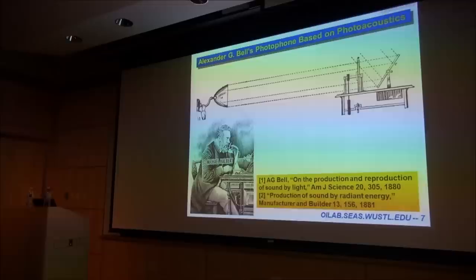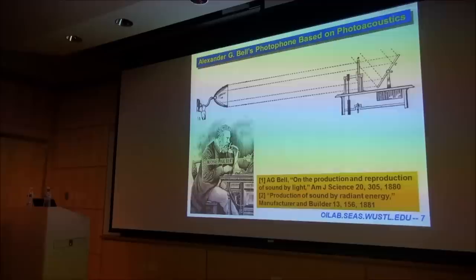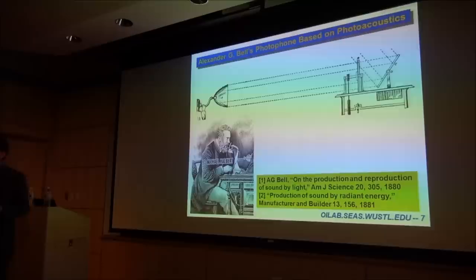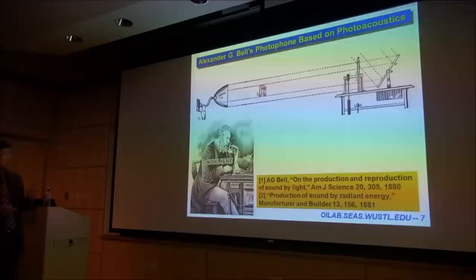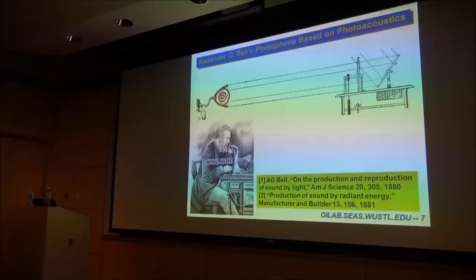As a physical phenomenon, photoacoustics has been around for quite some time. Alexander Graham Bell first reported the photophone over 100 years ago. Instead of building a telephone, he said, well, let's build a photophone. The idea is to encode a sound wave into a light beam, then propagate the light beam in space, and convert light back into sound again through this photoacoustic effect occurring right here.